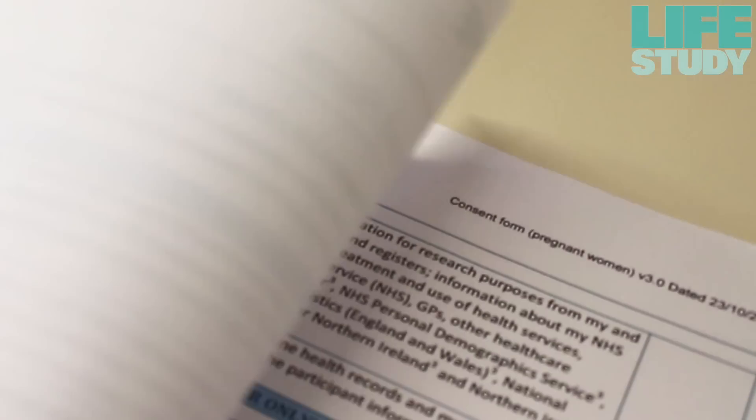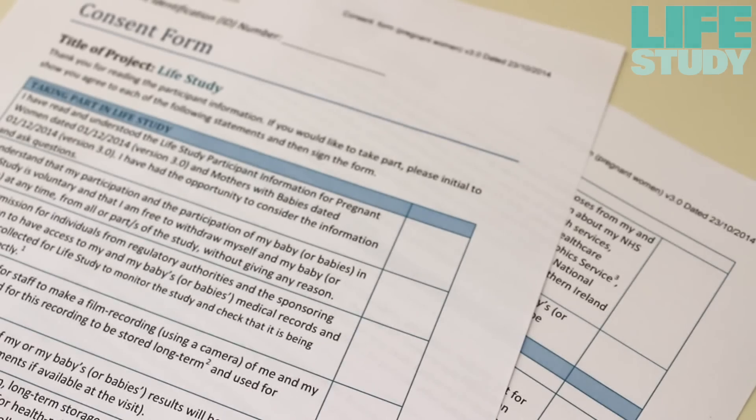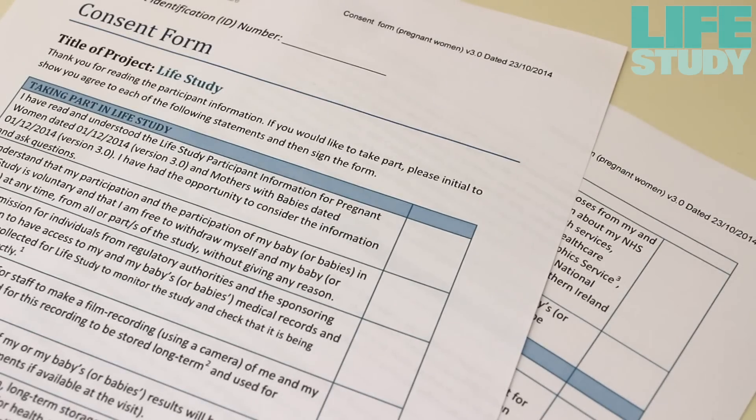Before you collect the sample, please check whether the woman has consented to give biosamples, and check she is happy to give a vaginal swab.